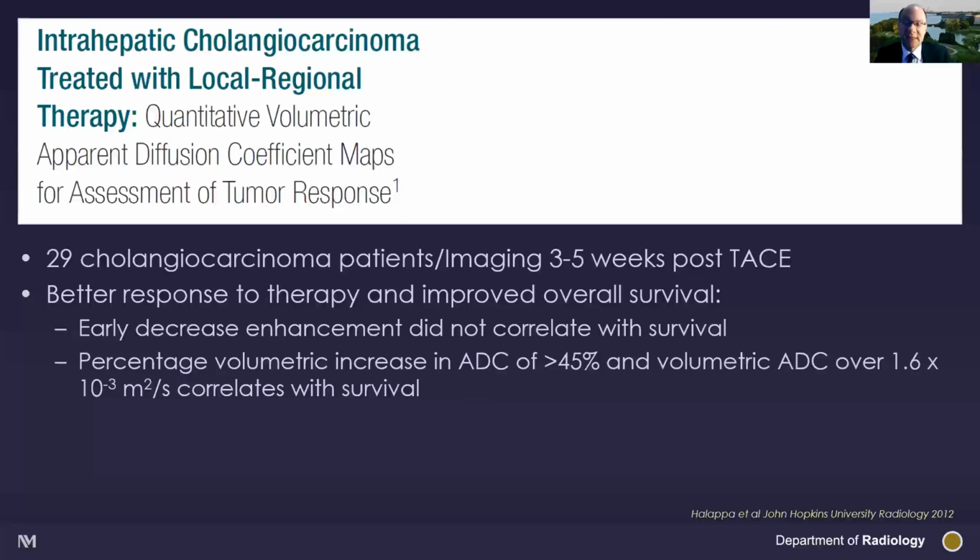This was a similar study from the Hopkins group, in this case looking at cholangiocarcinomas, which can be really hard to assess. They looked at volumetric ADC values 3 to 5 weeks after therapy following chemoembolization, and they found that an early decrease in enhancement didn't correlate with survival.